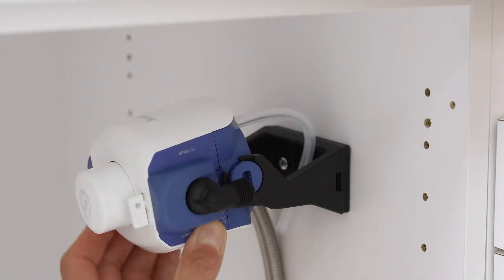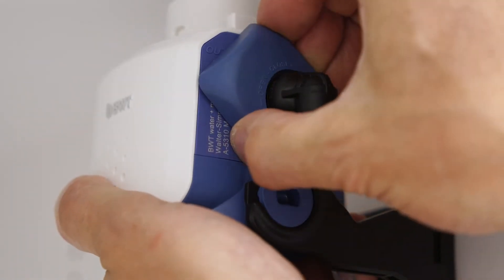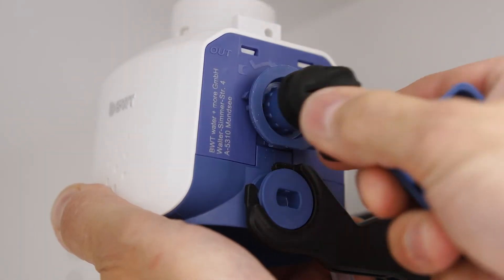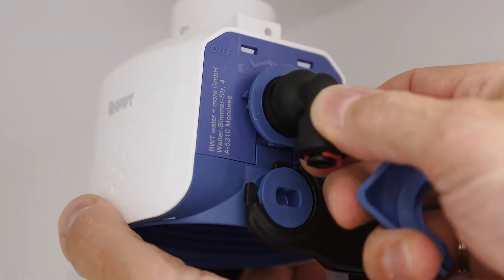Then place the filter head in the black wall bracket. Remove the elbow on the outlet side and mount either 6 or 8 millimeter push-in fittings.